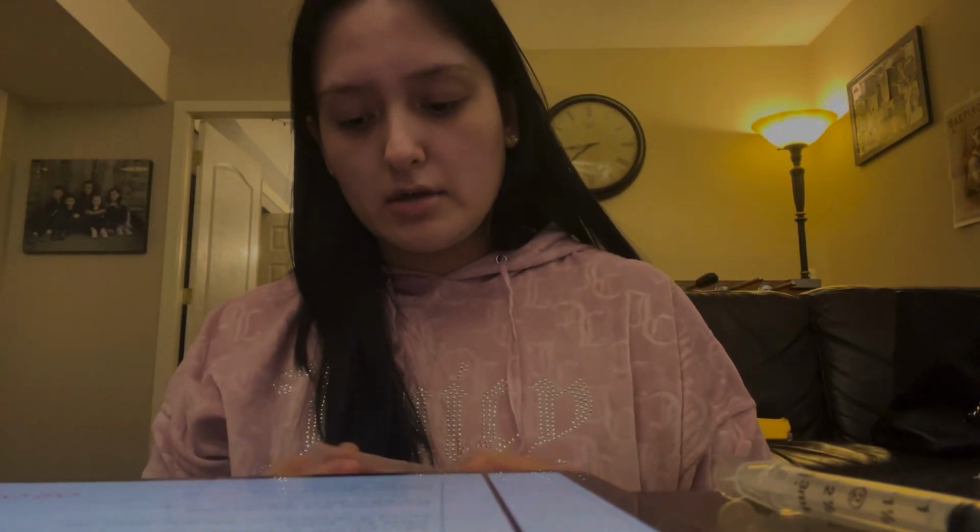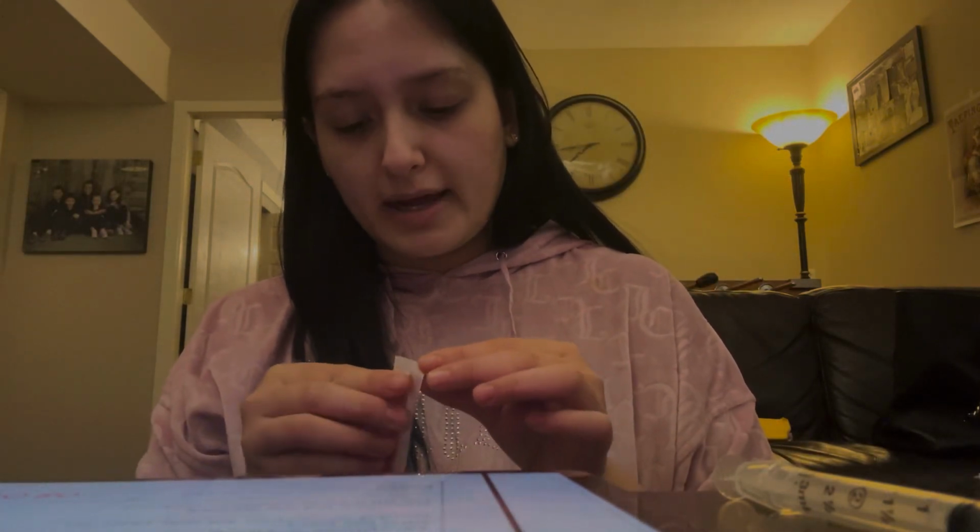I'm going to put this down, and then I'm going to perform hand hygiene once again before drawing up a milliliter of morphine. So now that I've done hand hygiene, I'm going to draw up 1 ml of morphine in this vial, but I'm going to be using a blunt fill needle filter. This is going to help prevent any glass shards getting into my syringe in the event that shards of this break off as I'm drawing the morphine. So I'm gonna unpackage this.